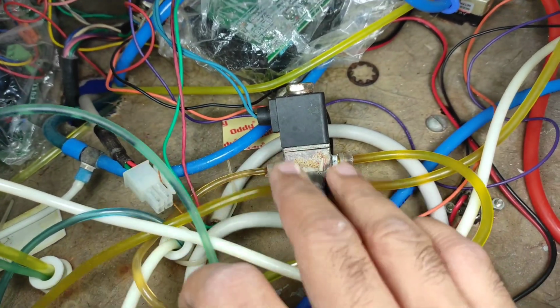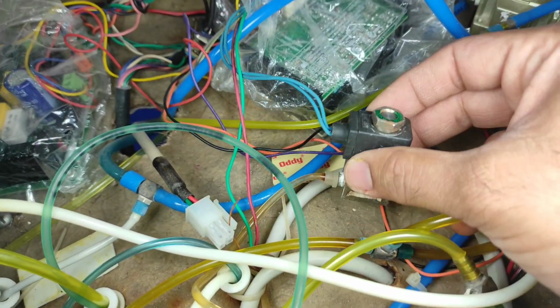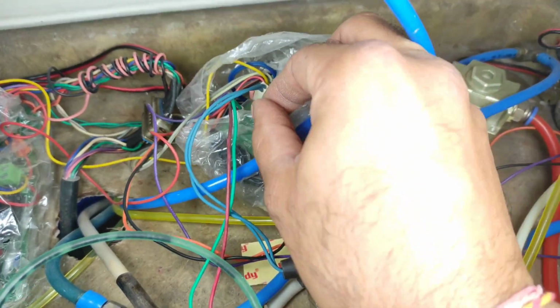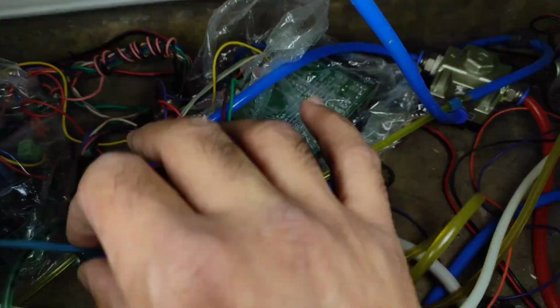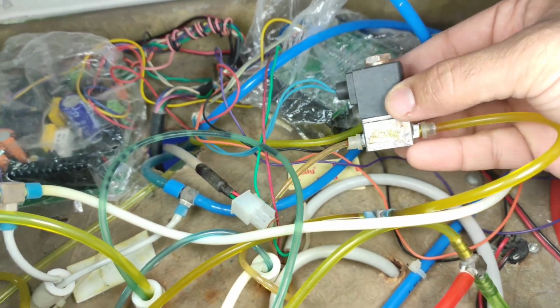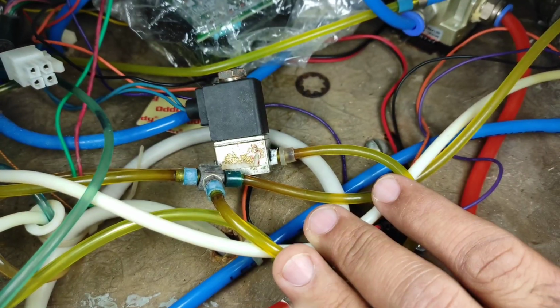Currently, coming back to our point, our main reason for water blockage is this, which is also called the solenoid for our scaler. This will be similar in your external scaler also. So if you don't have an internal scaler and you have an external scaler, you will have the same thing. Here you can see the solenoid was connected to my scaler circuit. I have removed that connection.